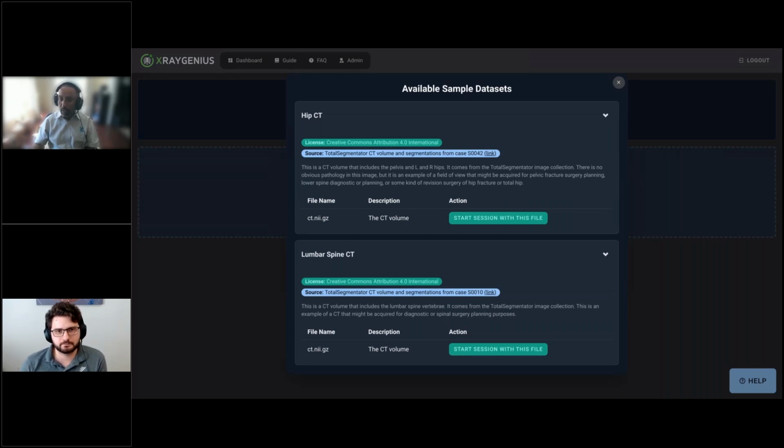The second question, does it cost anything? So right now you can create a free account, and I'll show the URL again at the end. You can create a free account and generate synthetic images with limited options. So currently we're allowing limited simulation sessions, just because we have one service, one server that's running.